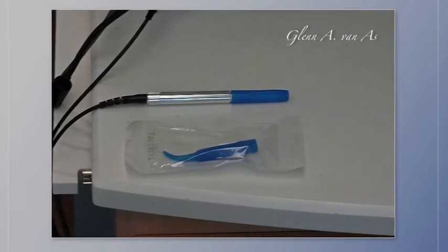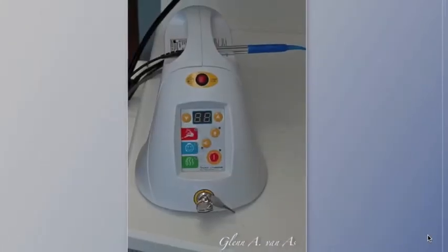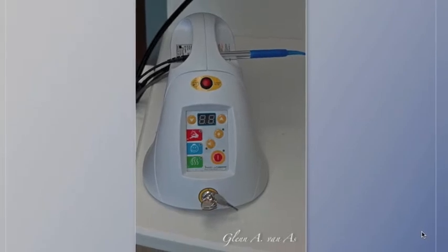The tips are removed pre-sterilized from the package. The blue cover cap is removed, and the tip is simply placed onto the top of the unit.